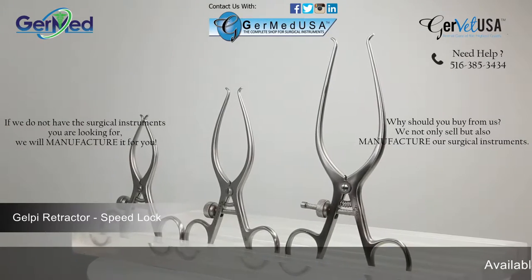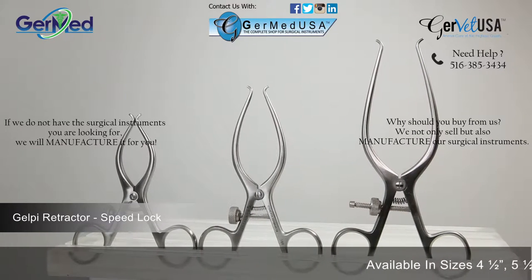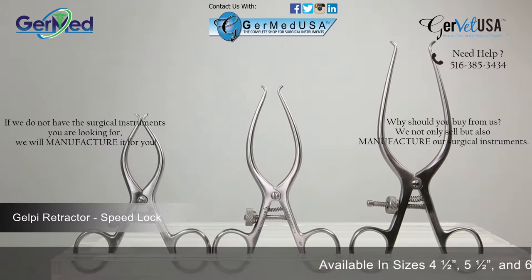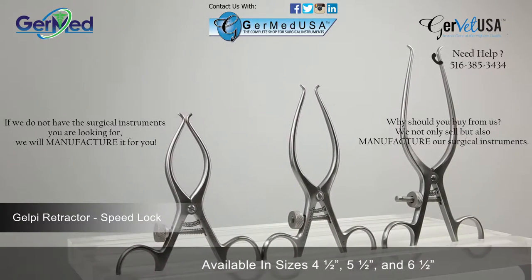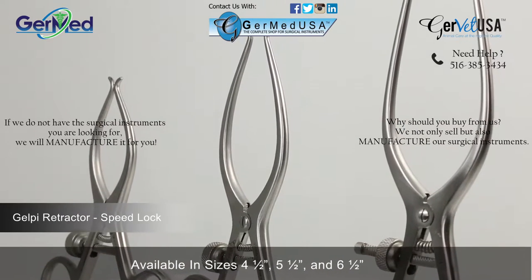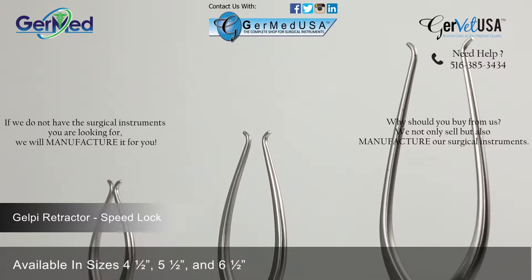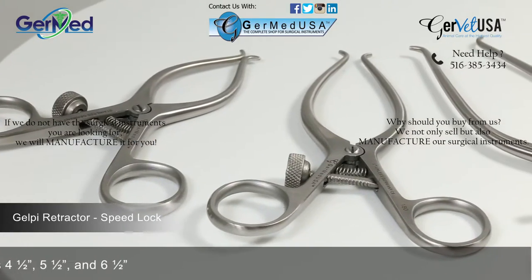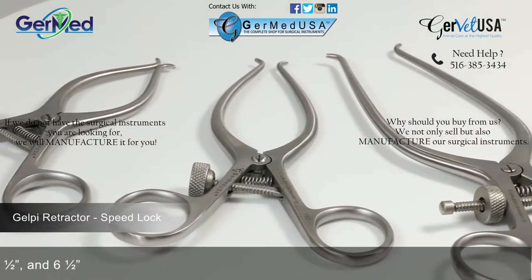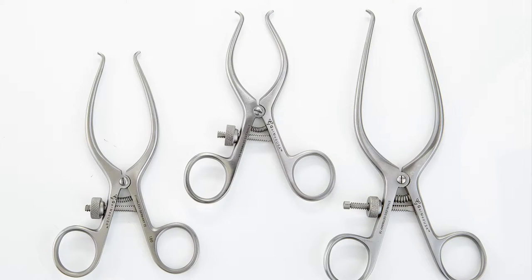GermEd provides the SpeedLock Gelpy retractor in a variety of lengths in order to correlate with the size of the patient. SpeedLock Gelpy retractors are a ratcheted finger ring instrument used mostly for spinal injuries. The SpeedLocking mechanism allows the retractor to remain in place and does not require someone to hold it during the procedure. It allows more control as well. The SpeedLock Gelpy retractor is available in sizes 4 1/2, 5 1/2, and 6 1/2 inches.